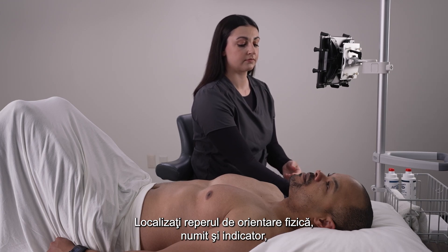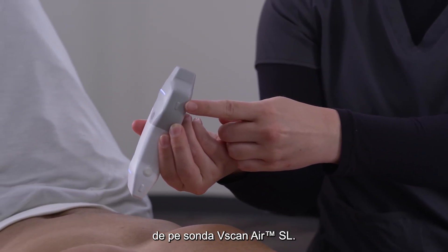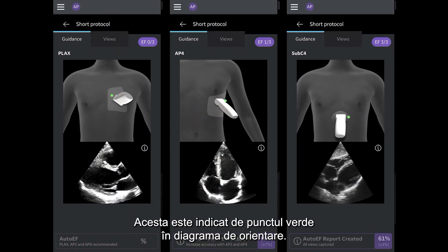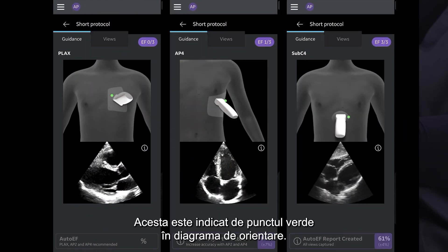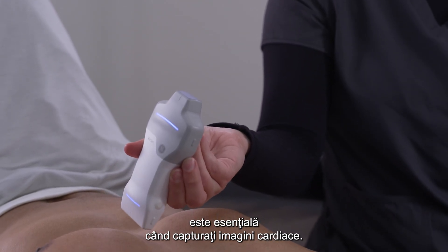Locate the physical orientation marker, also known as the indicator, on your vScan Air SL probe. This is indicated by the green dot on the orientation diagram. Knowing where the indicator is is critical when capturing images of the heart.